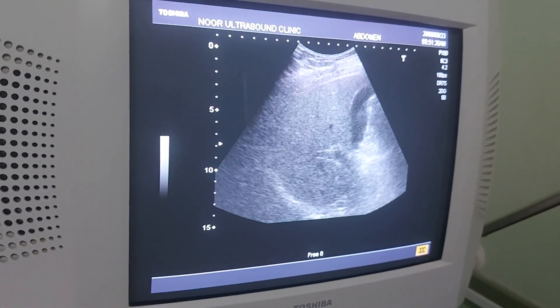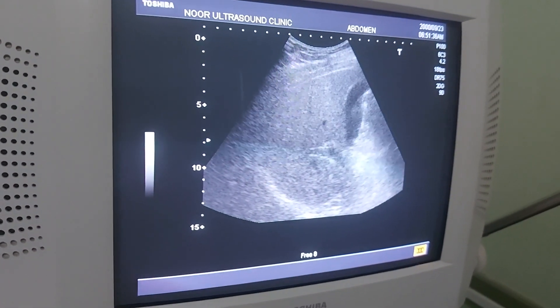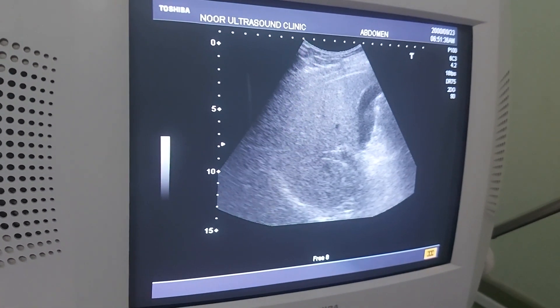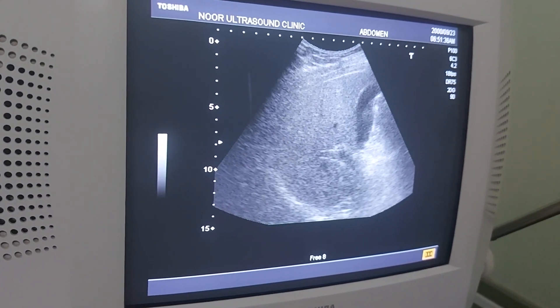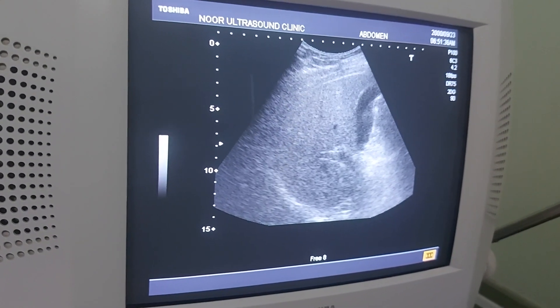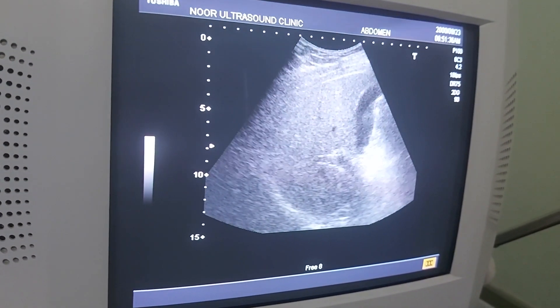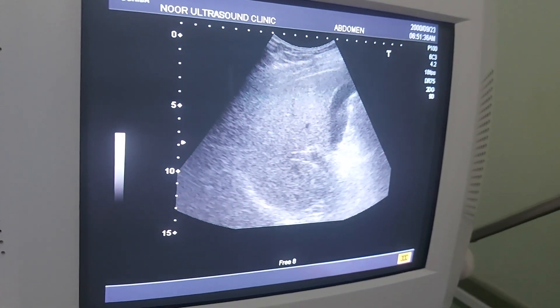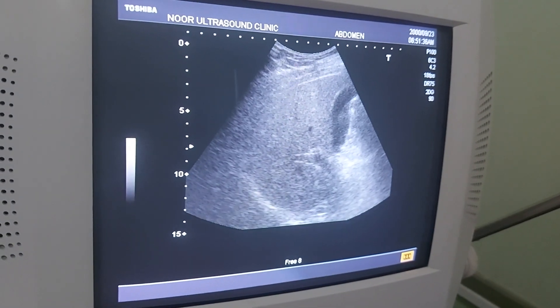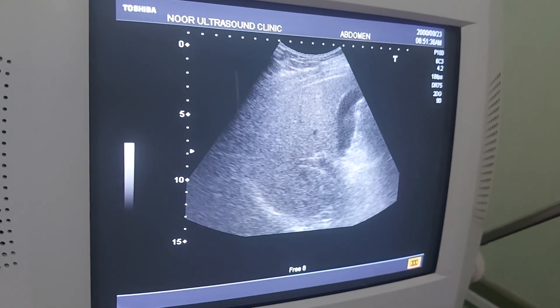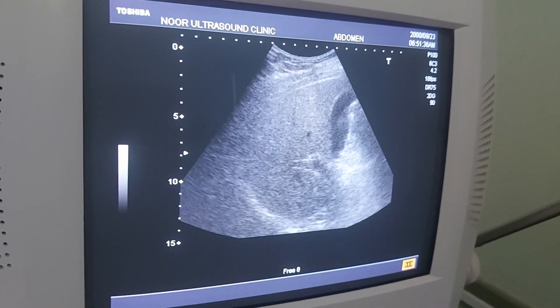The patient has presented with symptoms of pain in the left flank. An ultrasound was performed and there was an incidental finding of fatty liver.